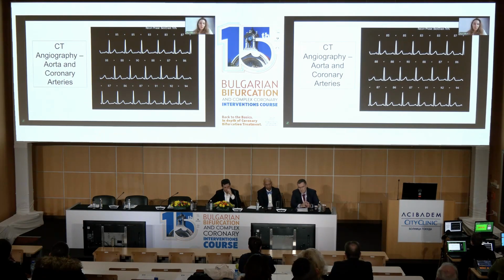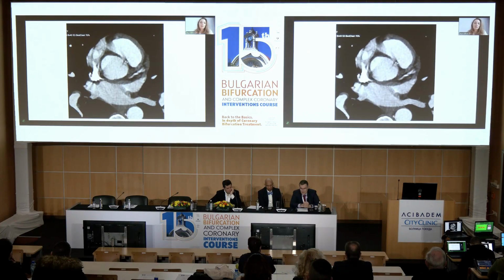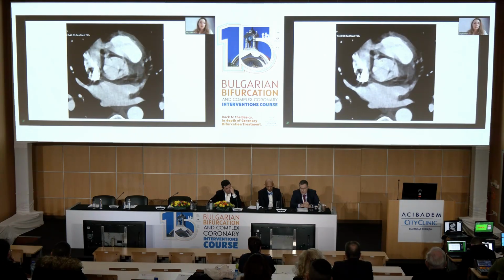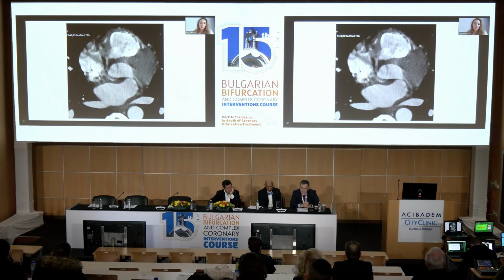This is the ECG from the CT. So the CT is definitely of lower quality. However, we saw that the aorta was perfect, definitely no signs of acute aortic syndrome, a little bit of calcification with calcium score around 60. So this is the CT, again with pretty bad quality. However, we could evaluate with the cursor that there is only one coronary origin. All coronary arteries are originating from the right coronary ostium, with the left coronary artery having a retro-aortic course.